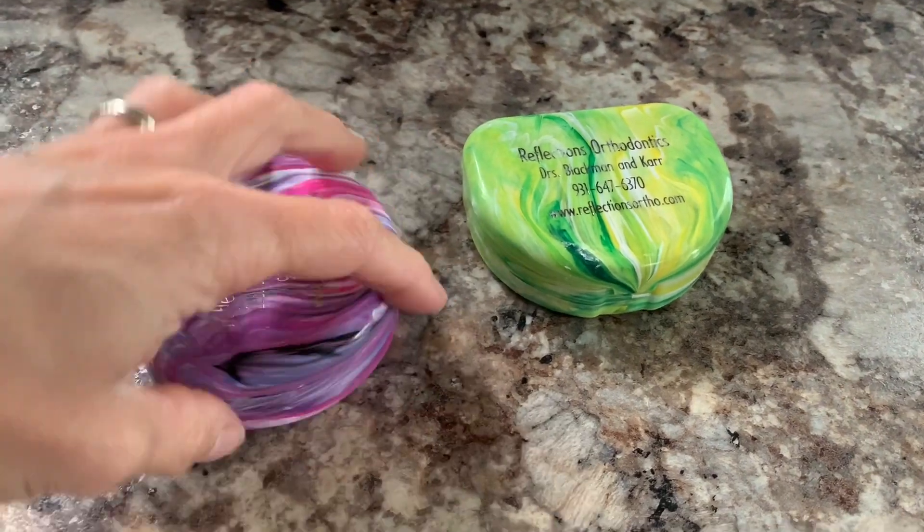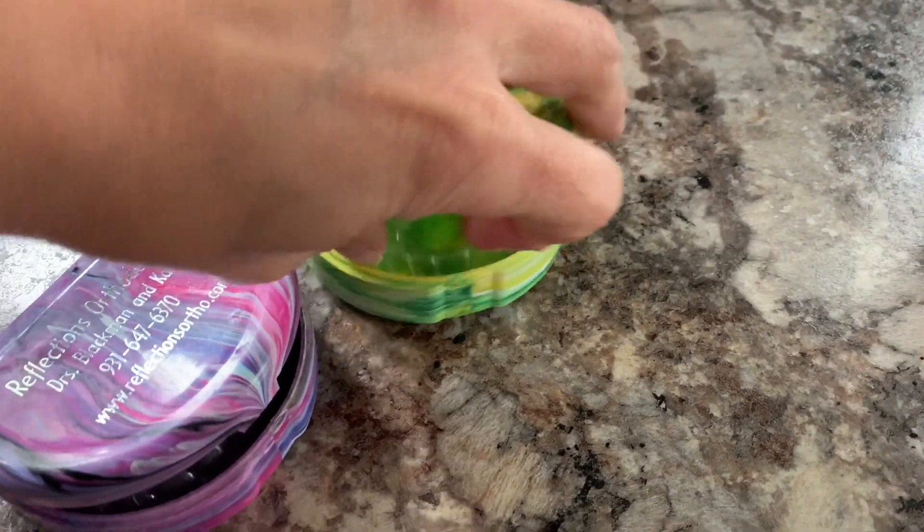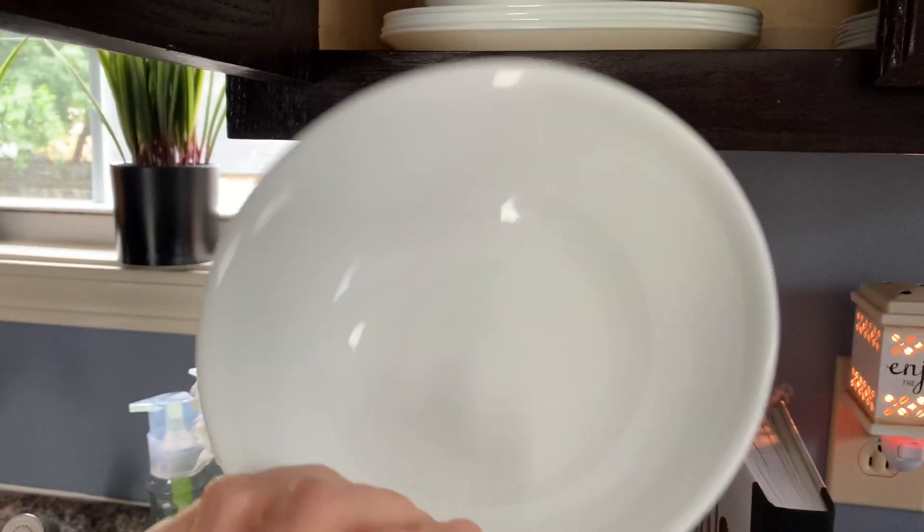In today's video I'm going to show you how I deep clean my retainers. The first thing you're going to need is a bowl — it can be a glass bowl, clear or white.